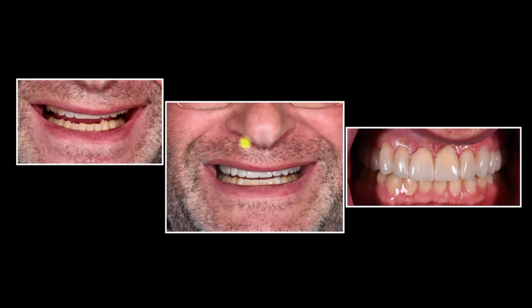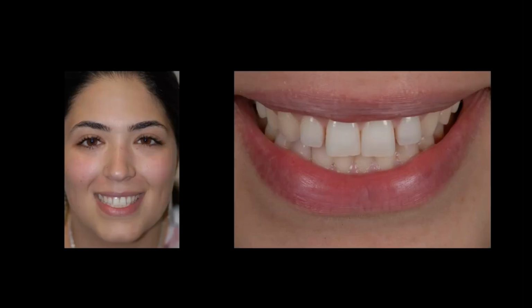I think he's actually in the chair as we speak, if I'm not mistaken, because I had asked the doctor if she wanted to join in on this lecture. He's actually in the chair right now. We're going to be doing the lower 6 veneers. We're going to be raising the vertical more from the upper. And I asked her to take a new scan now of what's in his mouth, because then I'm going to make some tweaks to my wax up and add that in when we insert the lower. So we really established that across the arch. So in the end, in the face, there are limitations that we have to be aware of.